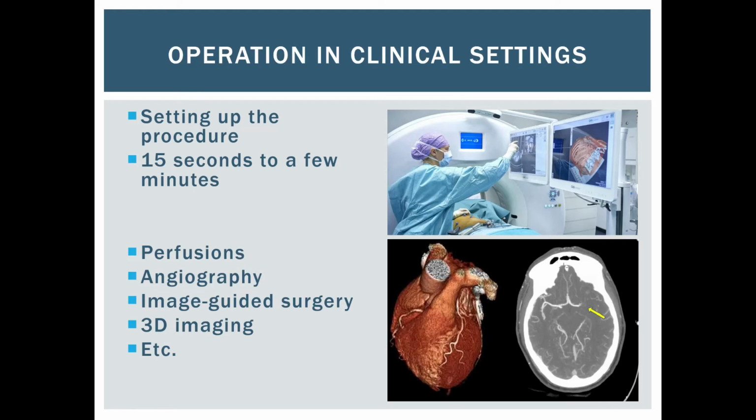The procedure itself takes about 15 seconds to a few minutes, depending on whether it's a head scan or a full body scan. Some applications for CT scanners include different organ perfusions, angiography, image-guided surgery, 3D imaging, and so on. As we can see from the picture here, it's an application for angiography, spotting a possible clot in the brain, and 3D imaging of the heart.